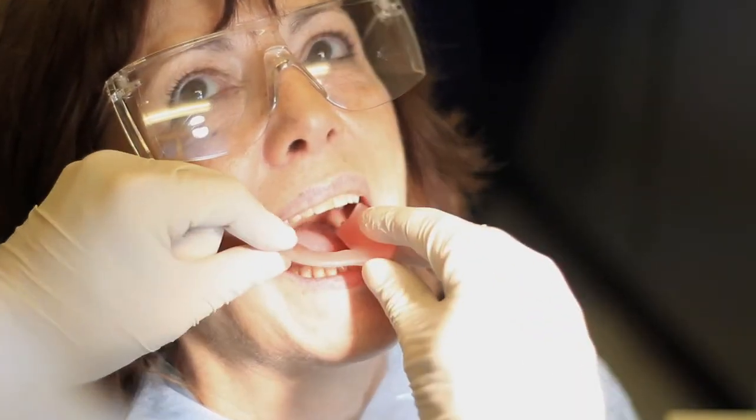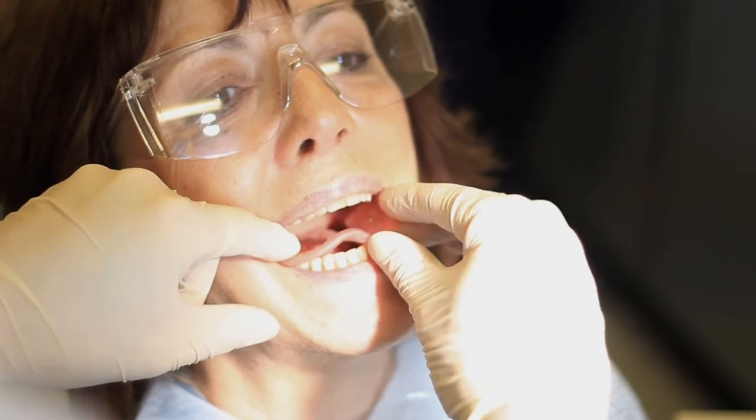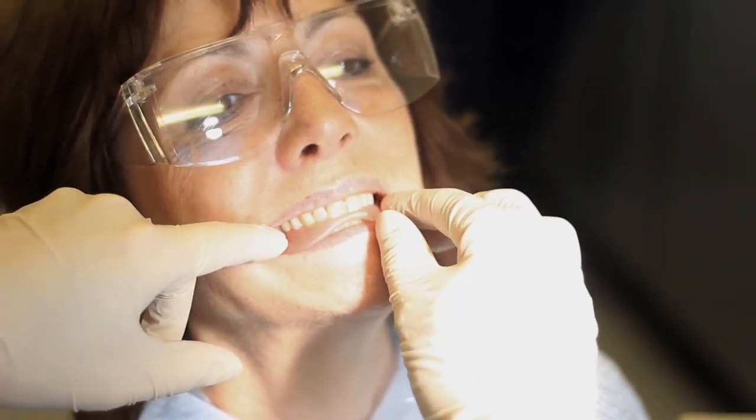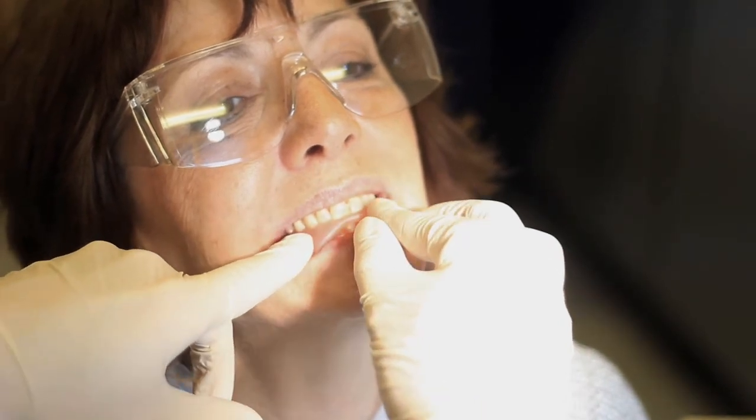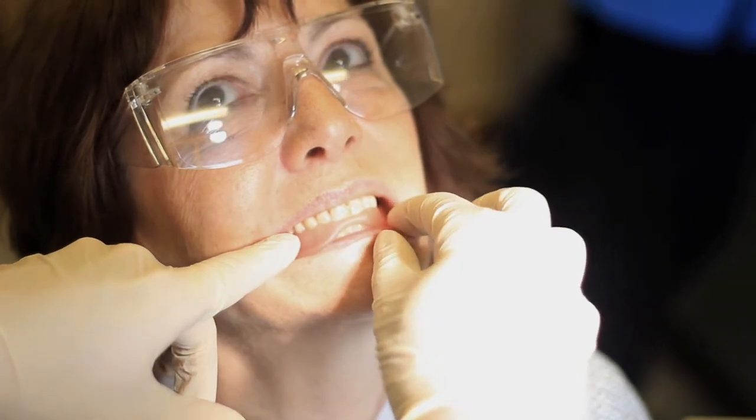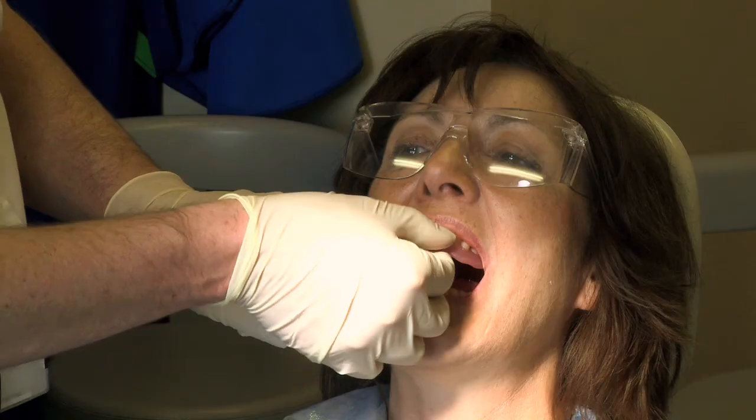Lower teeth, and then once I've got it in there, just get you to bite your teeth together now for me. That's super. And I'm just going to gently press it onto your lower teeth, and then you can open again and we'll take it out. That's super. Good, and then we'll put that into the tank.